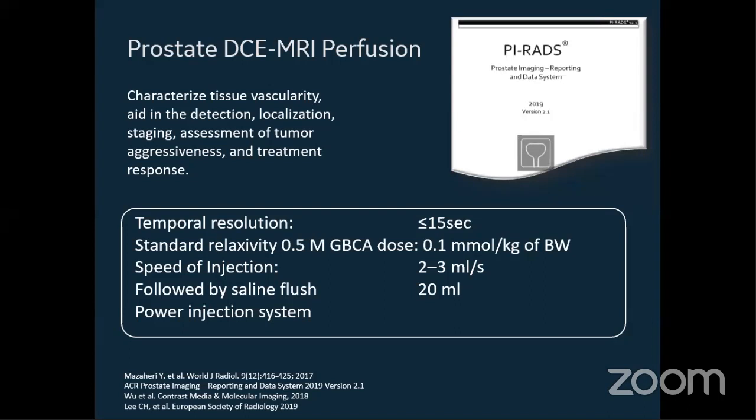From experience gained at Sapienza University Hospital in Rome, where Clariscan was used for prostate MRI in a 3 Tesla system, temporal resolution was 5 seconds, and Clariscan was injected with a speed between 3 to 4 milliliters per second. An additional tip by the radiographers was to start the MRI scan 2-3 seconds later with Clariscan as compared with higher concentration and relaxivity agents.